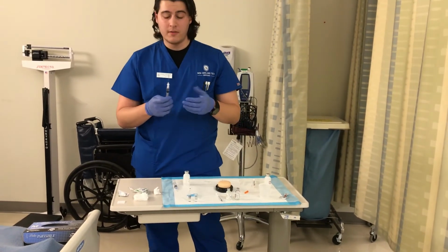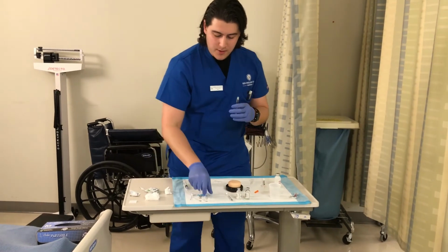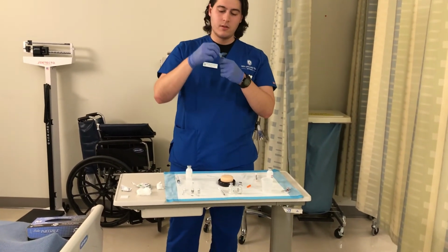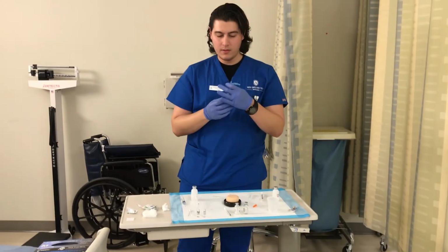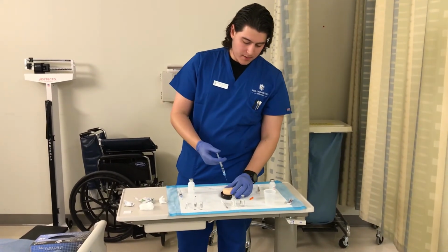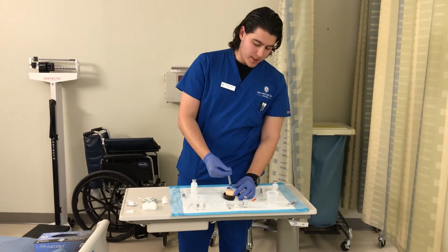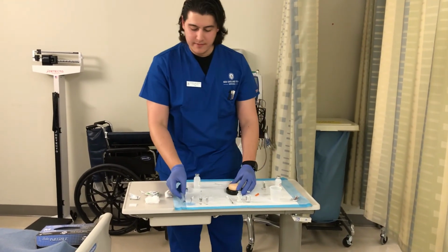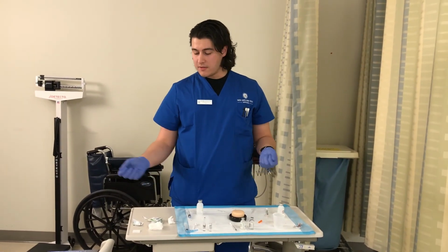And once you withdrew it with the filter tip, you would switch this off for a needle. And again, squeeze, insert after cleaning, inject the medication, and release. Sharps are always disposed of in the proper receptacle and clean up the area.